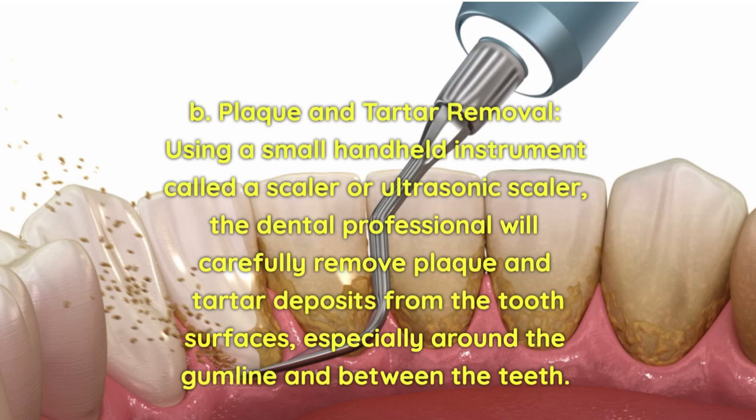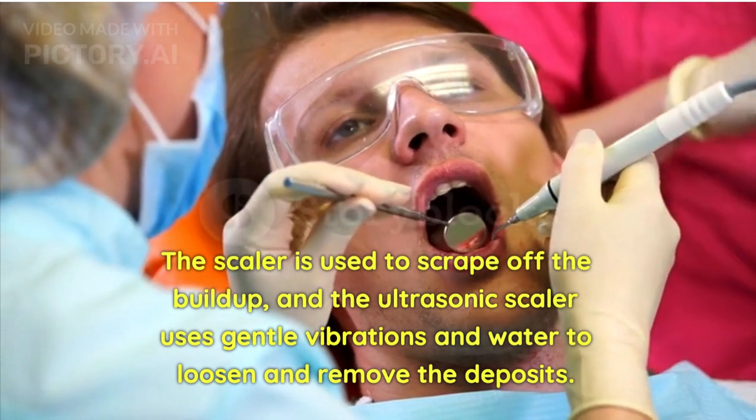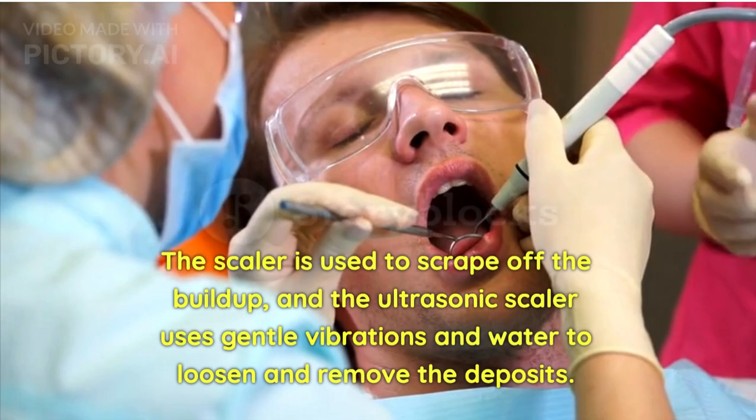Plaque and tartar removal: Using a small hand-held instrument called a scaler or ultrasonic scaler, the dental professional will carefully remove plaque and tartar deposits from the tooth surfaces, especially around the gum line and between the teeth. The scaler is used to scrape off the build-up, and the ultrasonic scaler uses gentle vibrations and water to loosen and remove the deposits.